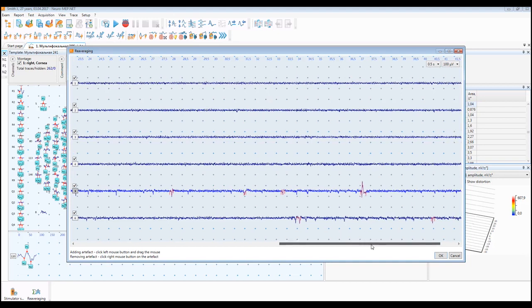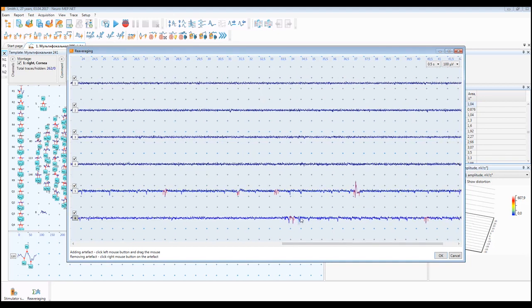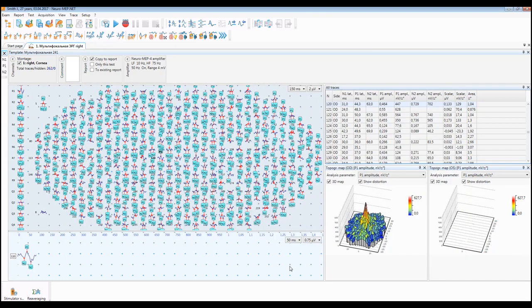When the selection of artifacts is over, we press OK button, and the reaveraging occurs. On the topographic map we also can see changes. Now we can review the necessary traces and adjust the automatically arranged markers if we need.